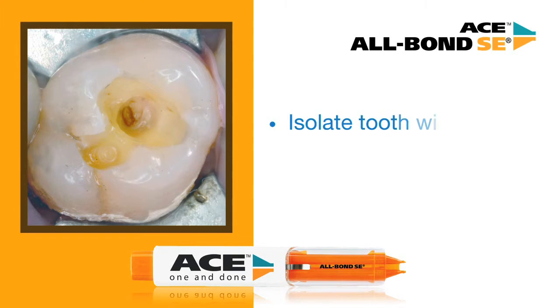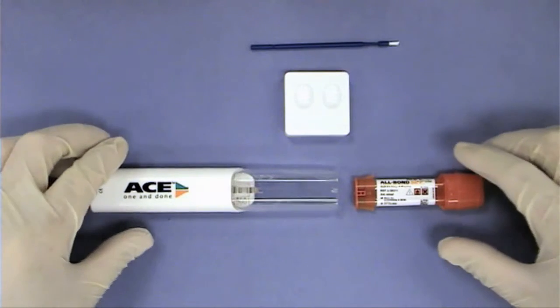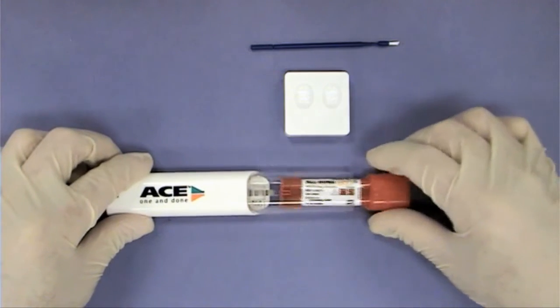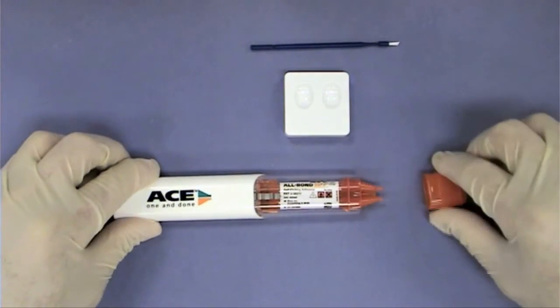Bisco has built all of this technology into a material that is easy to use. Isolate, clean and dry the preparation. Load the cartridge with label facing up and remove the cap.